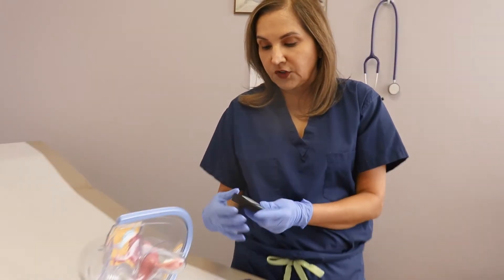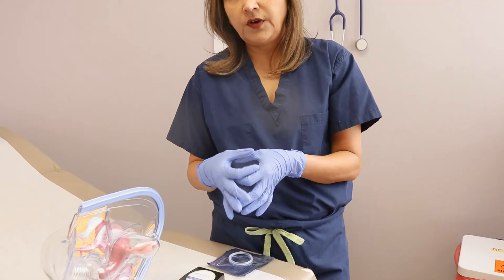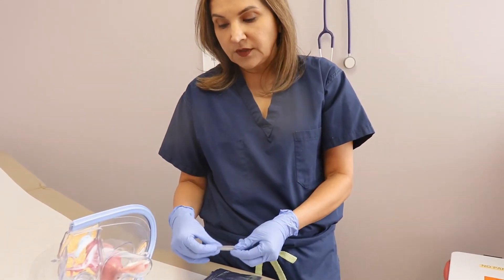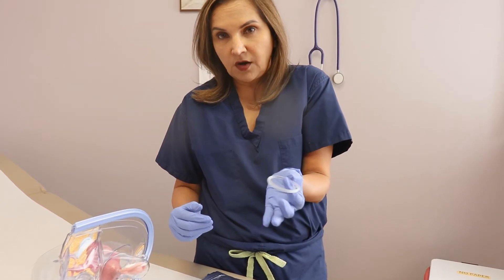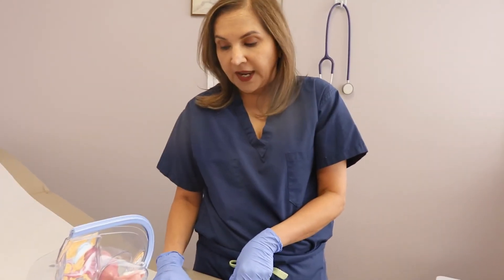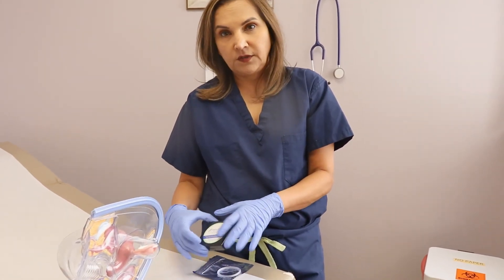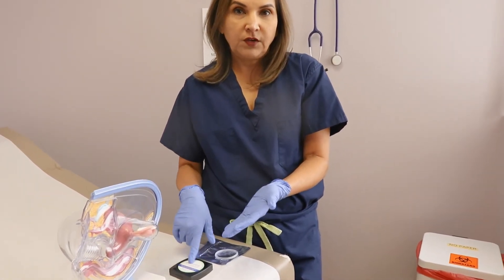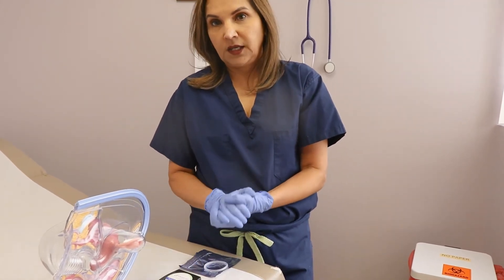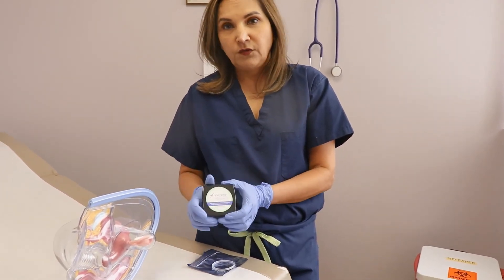The second ring on the market is Anovera. It's a little thicker than NuvaRing, but just as effective. With NuvaRing you toss it in the garbage after use since it's disposable. With Anovera, because it's good for a year, once you take it out just rinse it with warm soap and water and put it in the container they give you. It's the same schedule — three weeks in and one week out. At the end of that week out, when your menstrual cycle is starting, put the ring back in. The failure rate of Anovera is the same as NuvaRing — very low and very well tolerable.